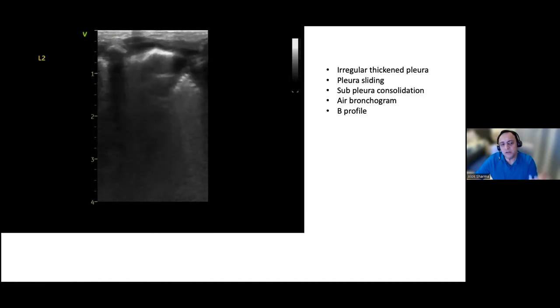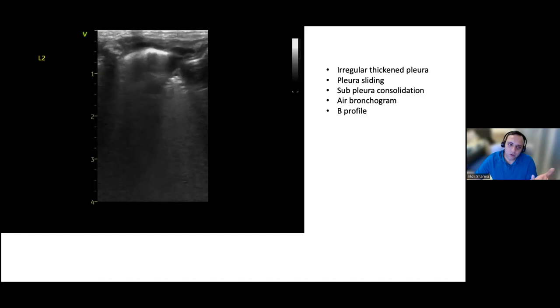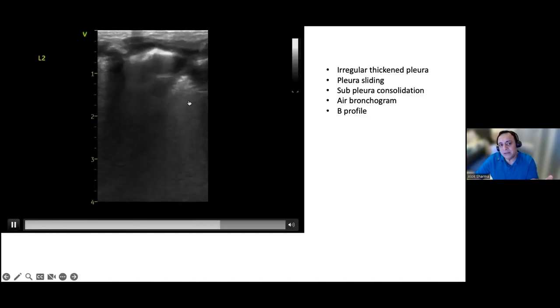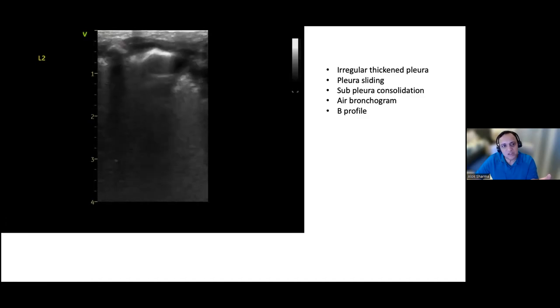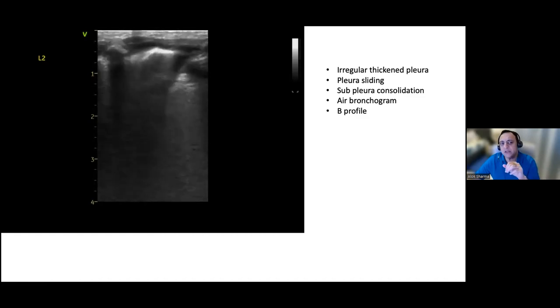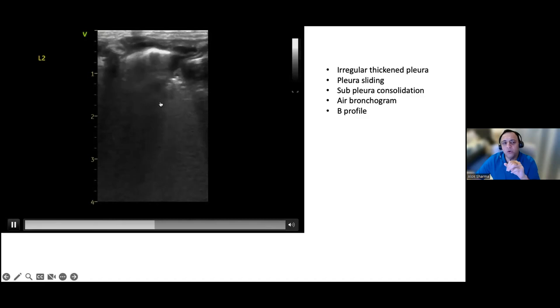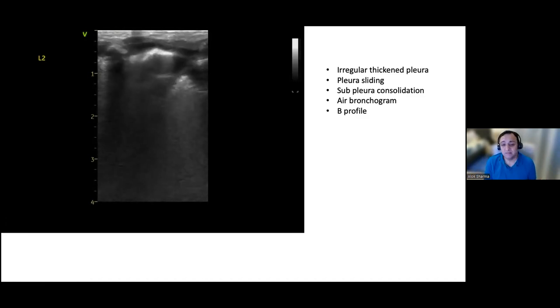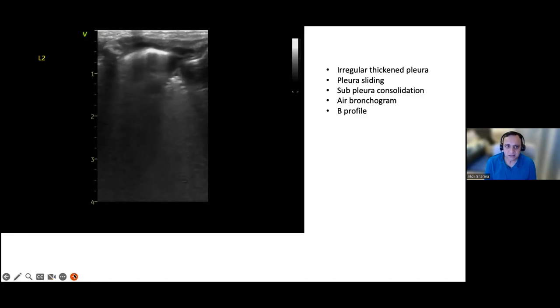With a superficial consolidation, or if you have a shred sign, what you'll find is the pleura is separated into a superficial and a deep region. And here I just cannot see the superficial pleura at all, which is why I think this is more a deep consolidation with atelectasis. Again, this would not be a shred sign. The margins also don't look as irregular. But it's a beautiful image. Well done. Definite air bronchogram, static subpleural consolidation, agree.